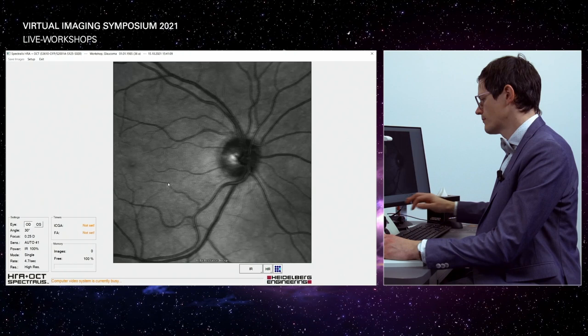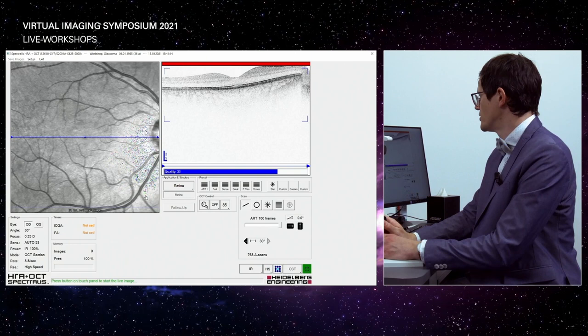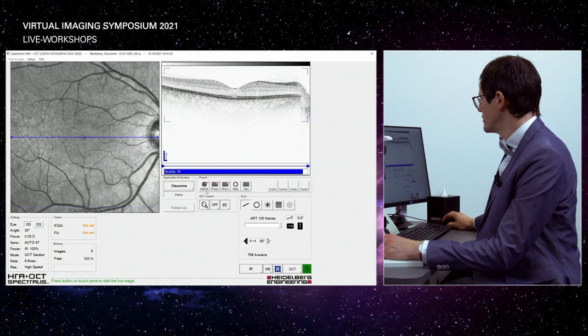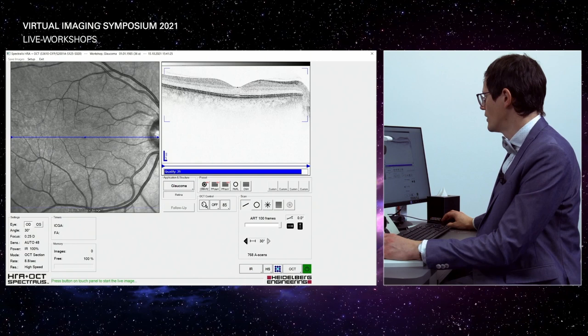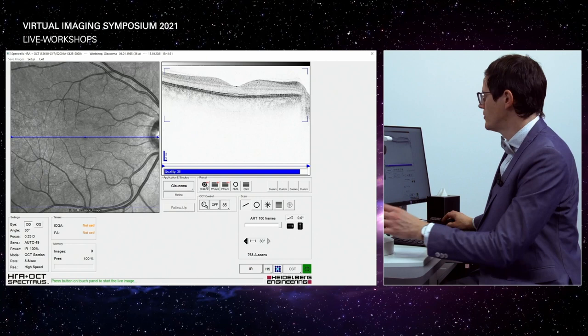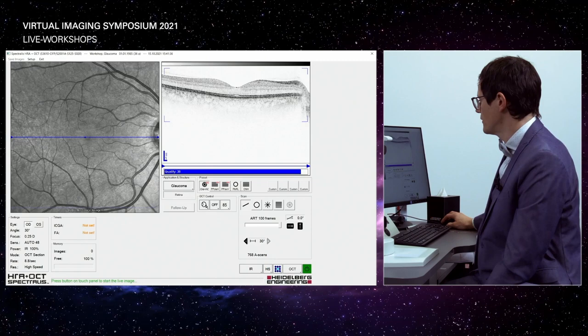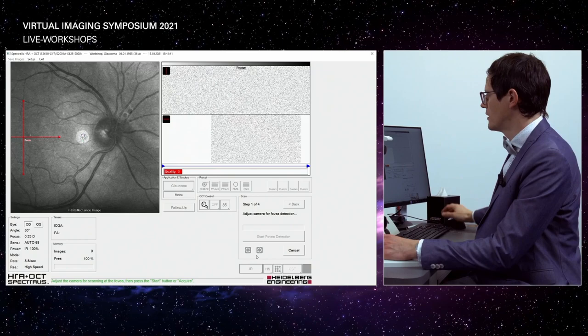Back again — patient looks perfectly straight in the same position. I select the glaucoma application and you can now see what I wanted to show you: the optic nerve head radial circle scan, which looks like a wheel. The three letters A, P, and S are red, meaning we are starting from the very beginning. I click on the icon.